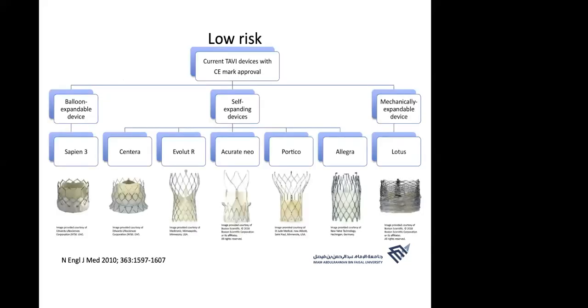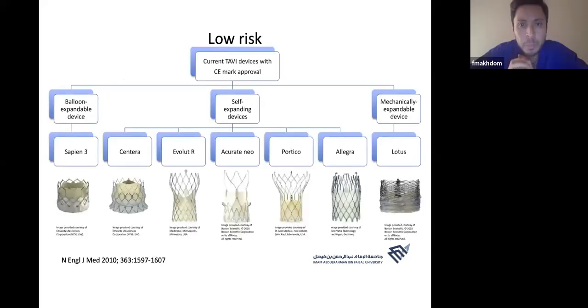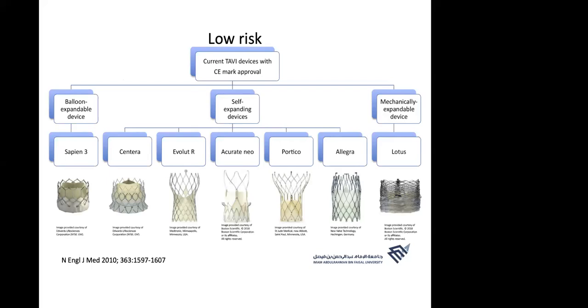Yes. Okay, so what prostheses are you guys aware of in the transcatheter world? CoreValve, yes, and Evolut. Yeah, these two.